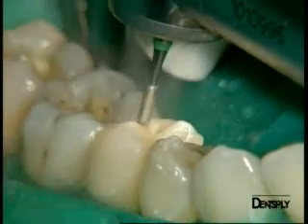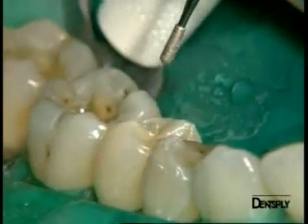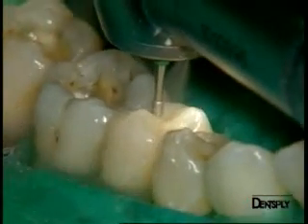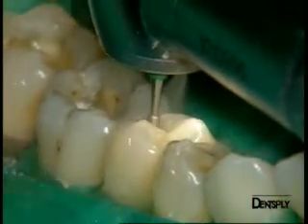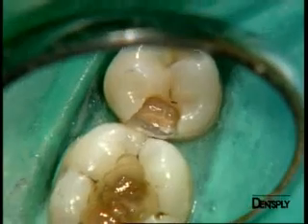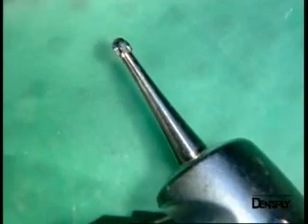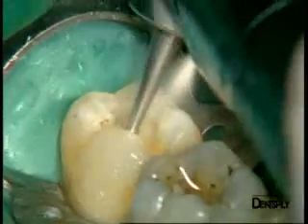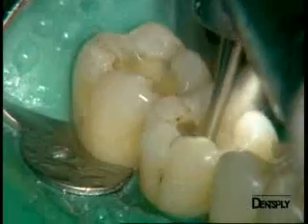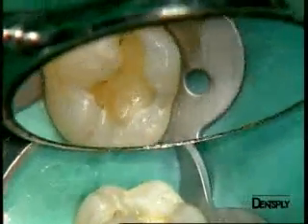We are very cautious when we open the premolar, as it has a very large caries lesion. We remove the marginal crest gradually, then access the caries lesion, and then slowly open the cavity, taking care not to damage the mesial surface of the adjacent tooth. Here is a view of the cavity that has not been cleaned yet. We start by removing the lesions with a small ball burr under teeth 6 and 7, where the secondary caries are relatively limited. We work under spray to avoid overheating.